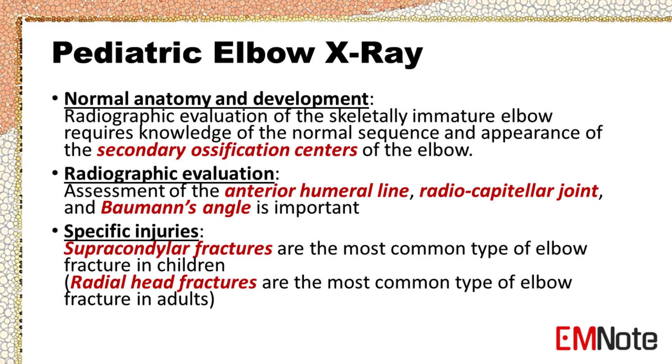When reading a pediatric elbow x-ray, it is important to distinguish normal from abnormal anatomy. Radiographic evaluation of the skeletally immature elbow requires knowledge of the normal sequence and appearance of the secondary ossification centers of the elbow. Assessment of the anterior humeral line, radiocapitellar joint, and Bauman's angle is important.